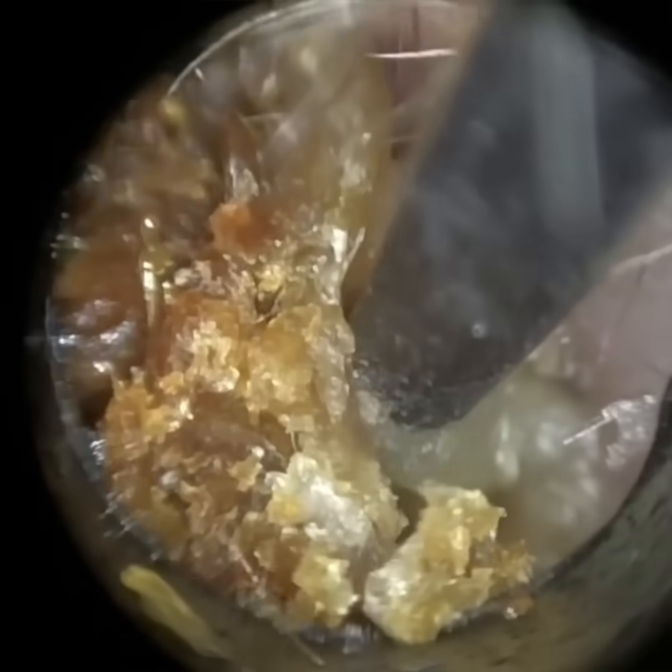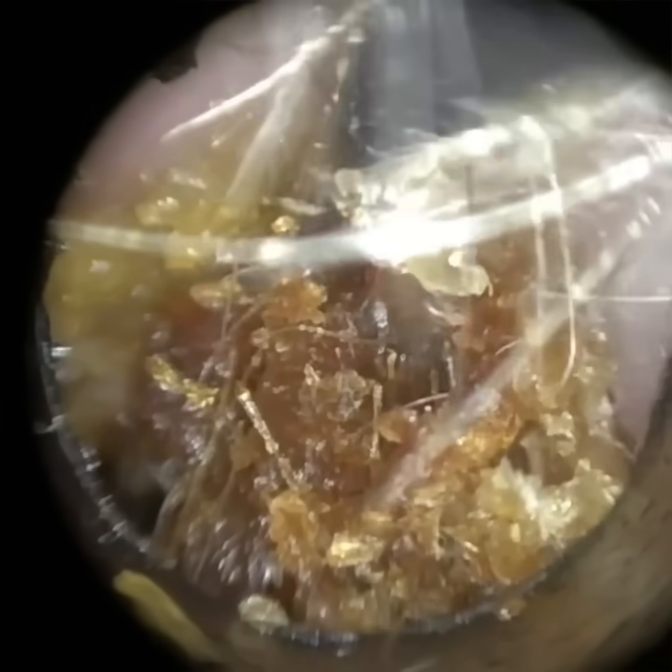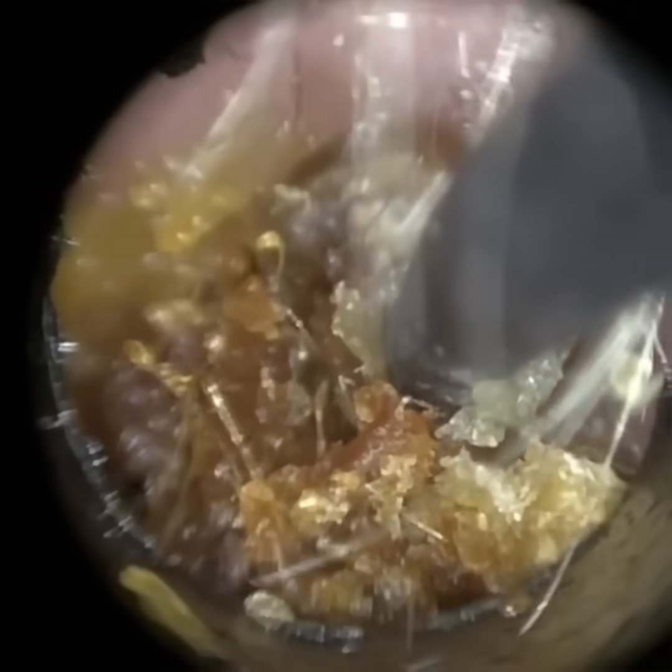So most head-worn microscopes, apart from one on the market, don't have that converged pupillary view. Instead, you are just using your own natural spacing between both eyes to view that wax in the ear. And quite often, because the ear canal is so narrow, you're not able to see the wax with both eyes. So you're getting monocular vision.